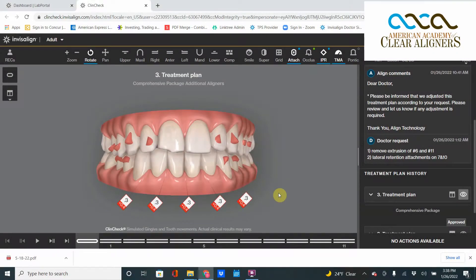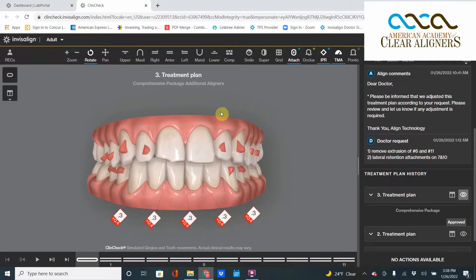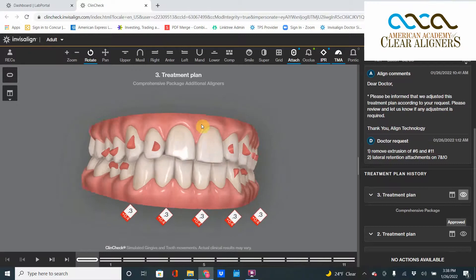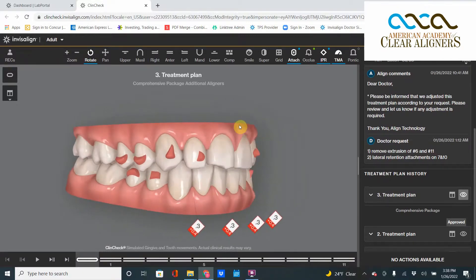Good morning and welcome to another edition of ClinCheck Theater Thursday. I am your host Dr. David Gallard, and today we have a fun little ClinCheck nuance to show you. This is a refinement — we're doing a little bit of touch-up — and in the initial ClinCheck we pick up an old glitch friend that I've talked about before.